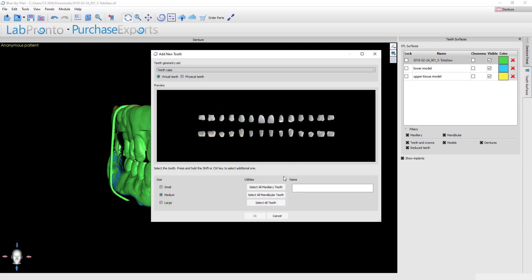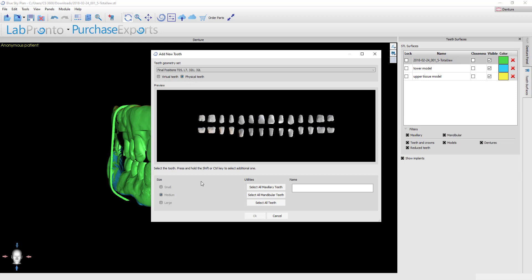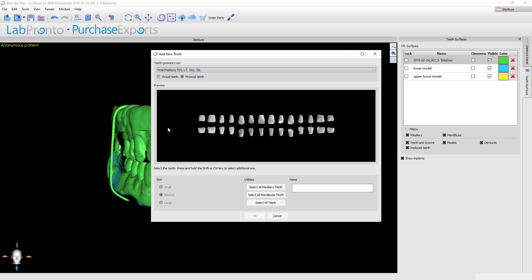Here we need to choose which library of teeth we're going to use. You've got the choice: do you want to use virtual teeth or do you want to use physical teeth? If you choose the physical teeth, then these are going to have the Nobilium teeth options that we have.